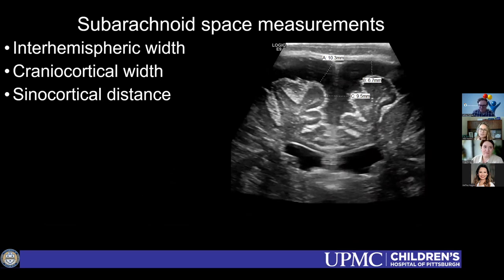What measurements do you use for your subarachnoid spaces at the vertex with concern for benign macrocrania or benign enlargement of the subarachnoid spaces? Two names for the same thing. Or do you measure? Yeah, this was pretty new for us. We probably introduced these measurements about 6 months ago now.